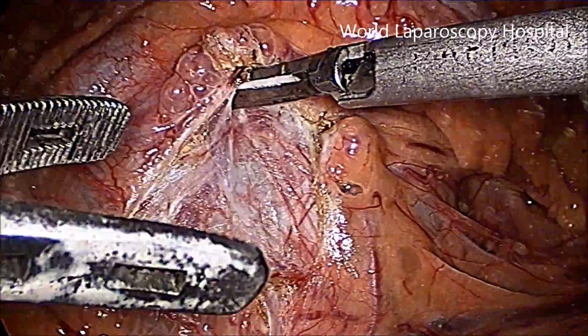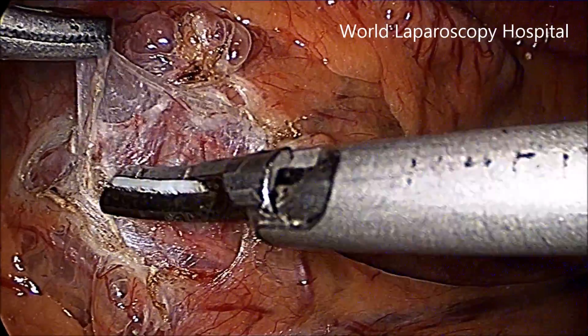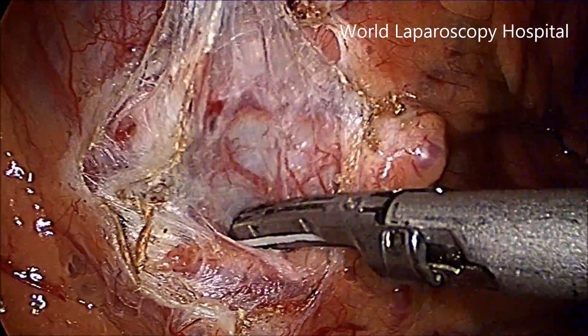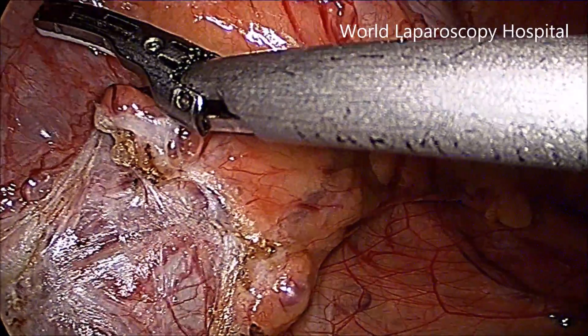In PUJ obstruction, it is important that you have the DJ stent introduced. So in this patient, we have introduced the double-J stent before doing the procedure by cystoscopy.